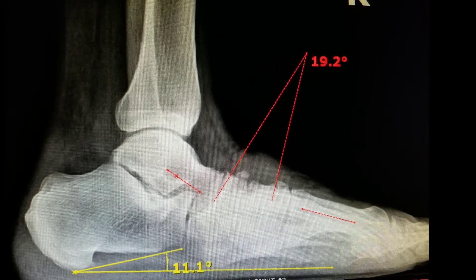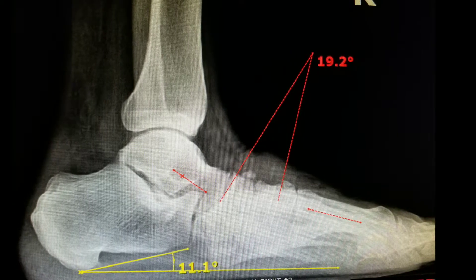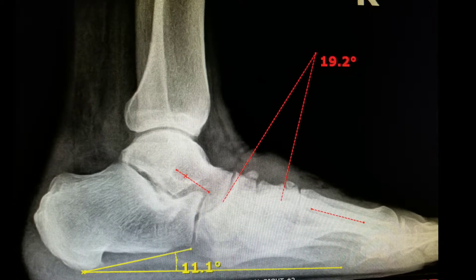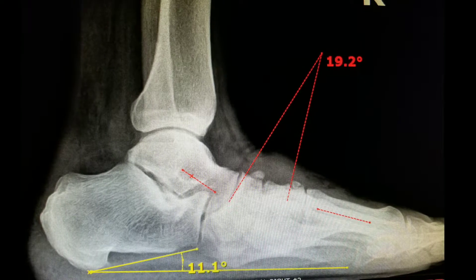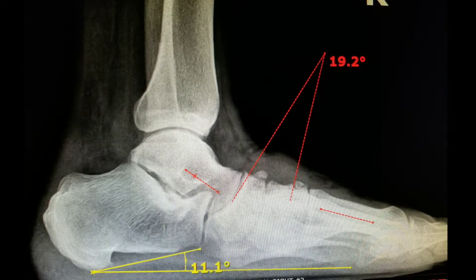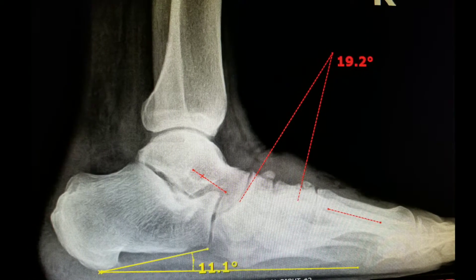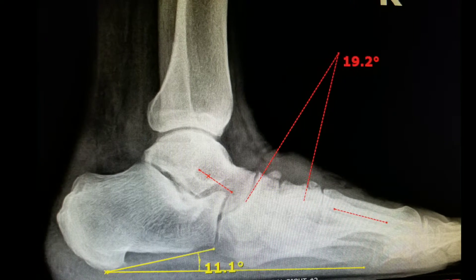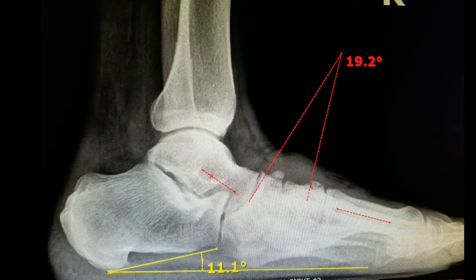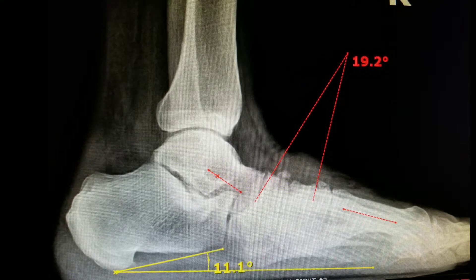When doing a Charcot foot reconstruction, one must consider all the angles and relationships of the bones, where to make the cuts in the bone, and the type of correction that needs to be obtained. Here, we use digital radiography to recognize Meary's angle as a 19.2 degree angle, which is significantly high in comparison to the norm, as well as a significant drop in the calcaneal inclination angle.